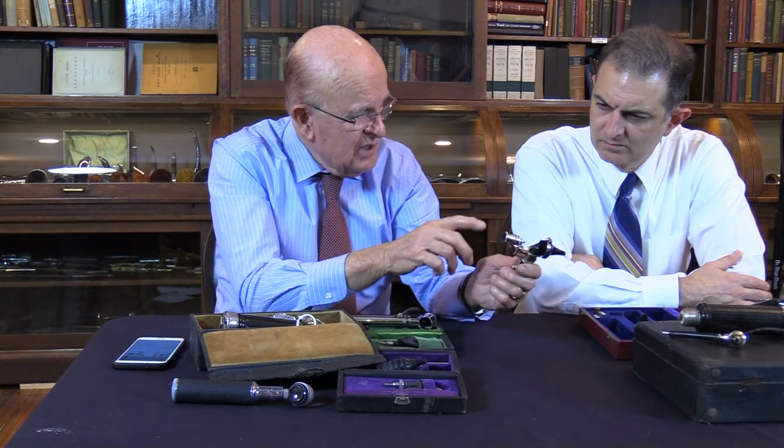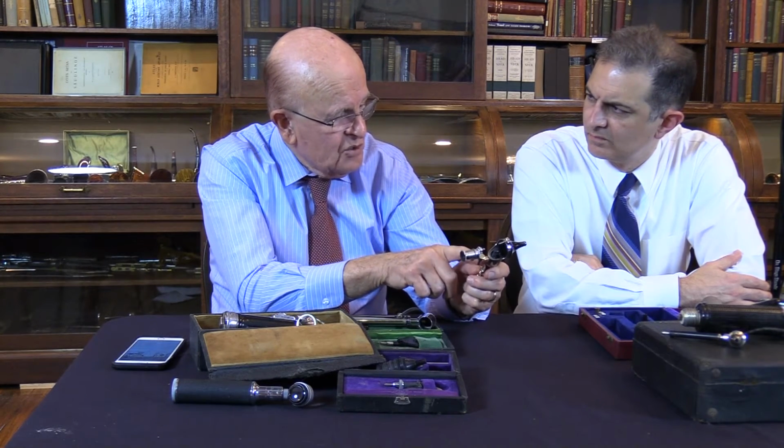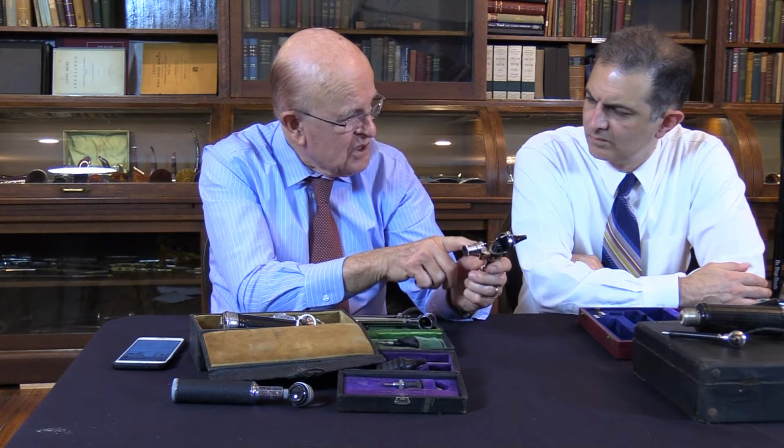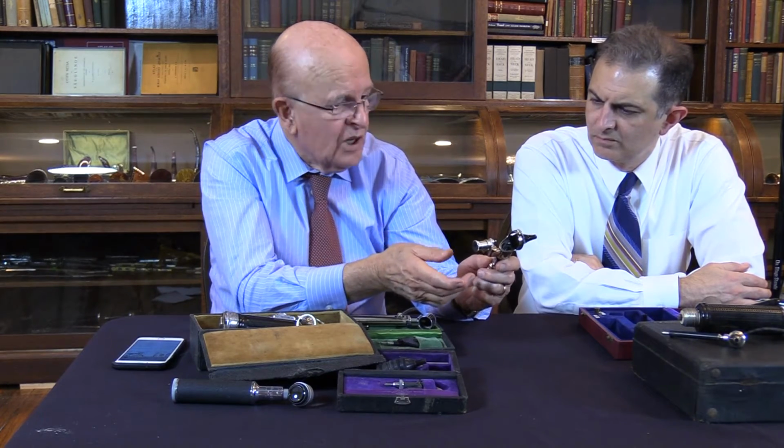And the most fascinating thing about this, I imagine this is what they used in the early part of the 20th century to do stapedectomy in Vienna, in Austria, because they didn't have the operating microscope, and that's how they used magnification to do procedures in the ear canal and the middle ear.